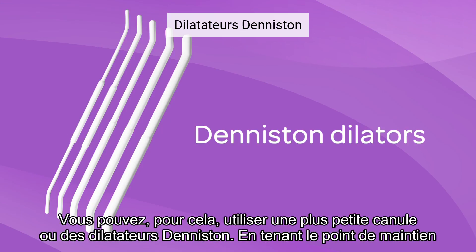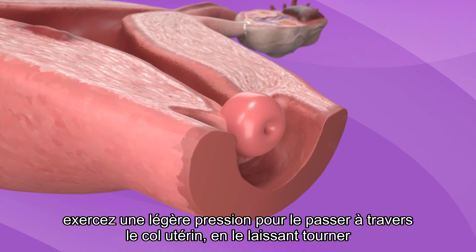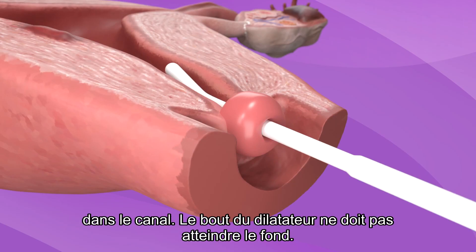For dilation, you can use smaller cannulae or Deniston dilators. By holding the midpoint of the Deniston dilator, use gentle pressure to pass it through the cervical os, allowing it to rotate through the canal. The tip of the dilator should not reach the fundus.